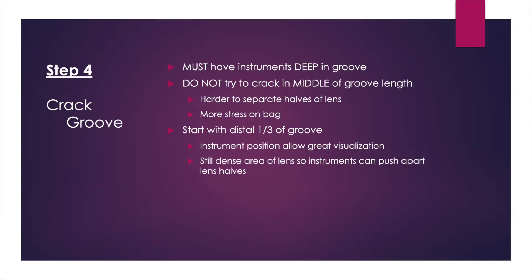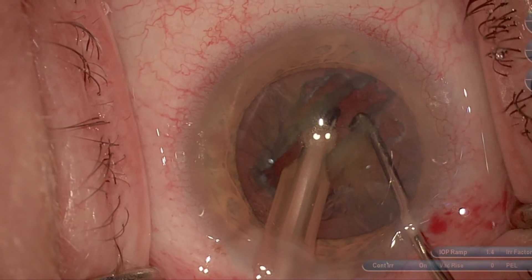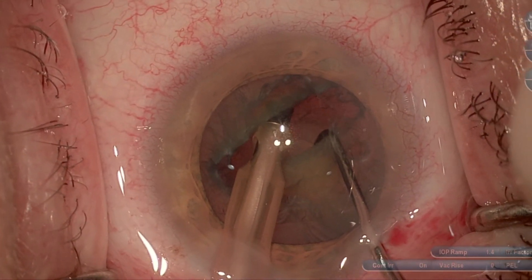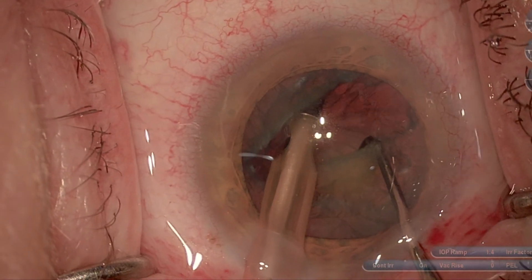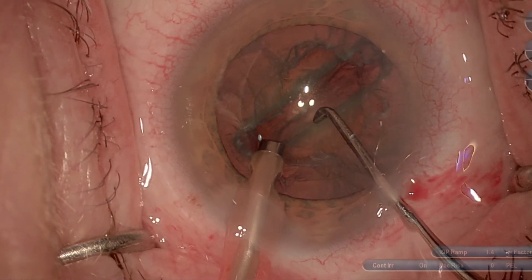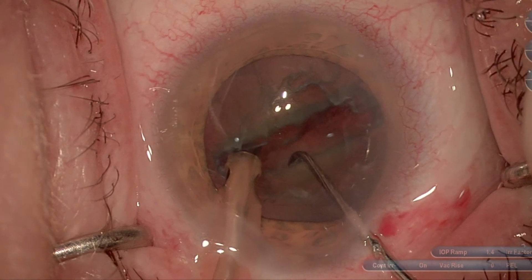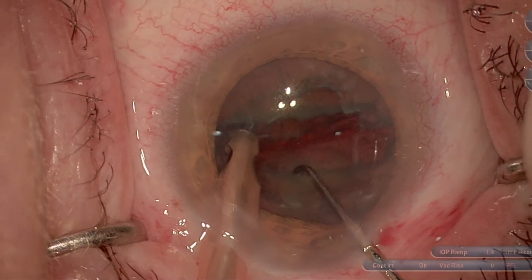Then you want to start to unzip from the initial crack. The initial crack is in the distal third, but then I'll march along my groove to extend this crack and create two halves. I find this is easier to visualize and a little easier on the bag as well.